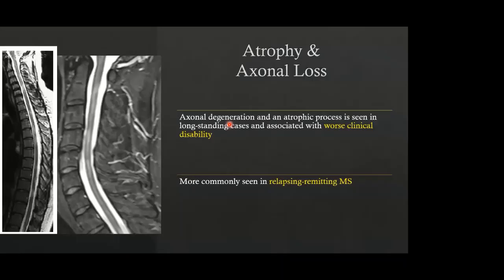The third pattern is atrophy and axonal loss. This is seen in long-standing cases and is associated with worse clinical disability. It is seen in the chronic relapsing-remitting forms of MS. On these images, thinning of the cord can be seen in multiple locations where the plaques are present, indicating the atrophic or axonal loss pattern.